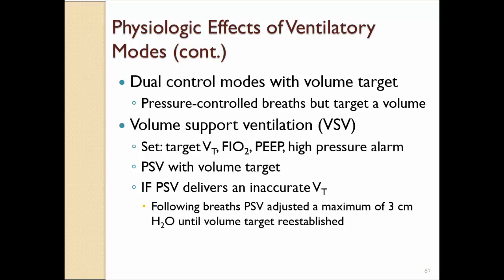We've talked a little about dual control modes with a volume target.